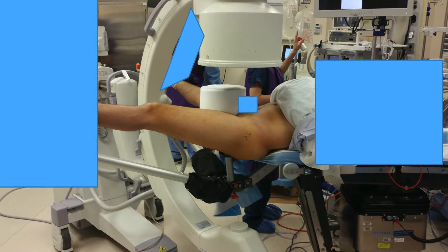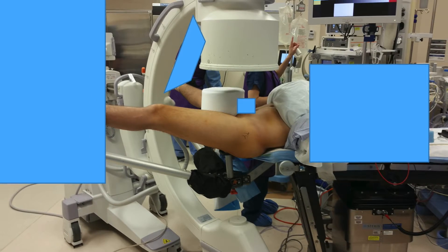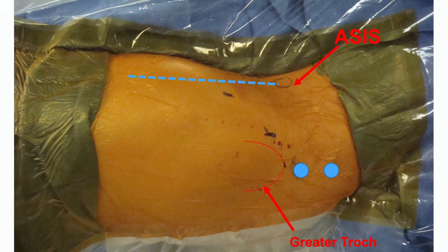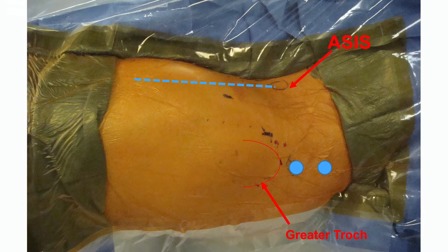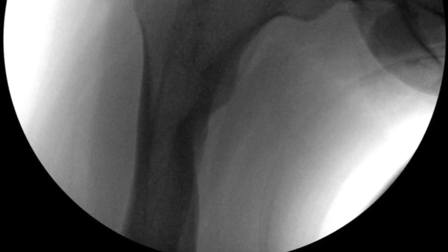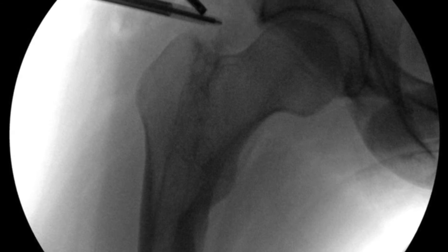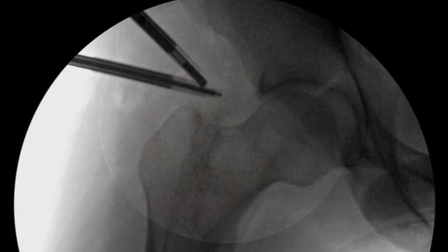When setting up for surgery, I recommend positioning the C-arm in between the legs so you can achieve AP and lateral views of the hip. We used the proximal and distal peritrochanteric portals, which approach the HO laterally rather than posteriorly and avoid risk of damage to the sciatic nerve. The C-arm was then used to triangulate our scope and instrument on the HO.